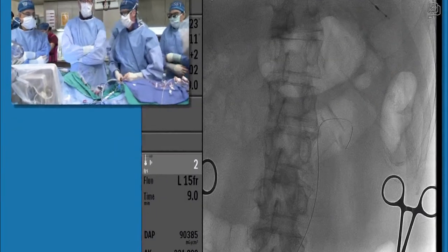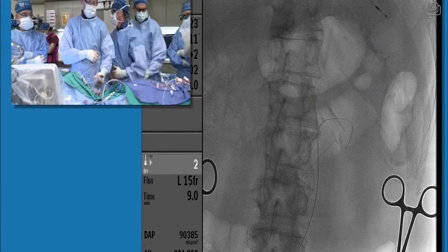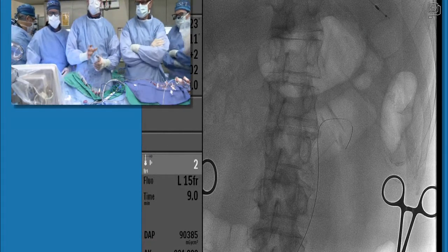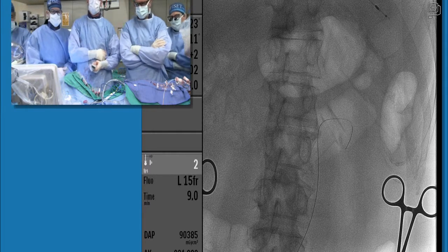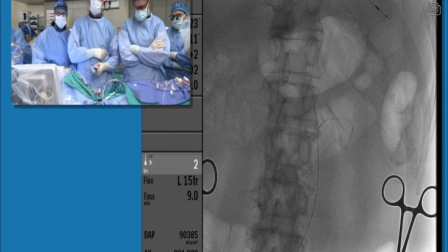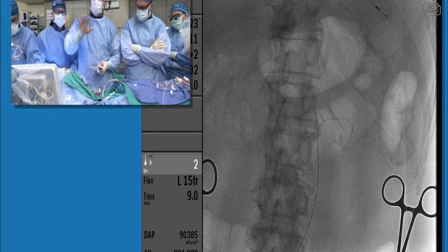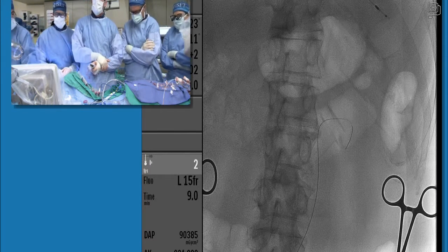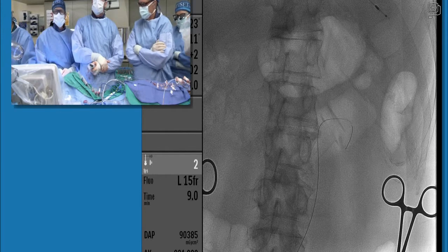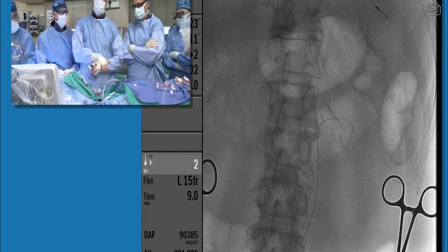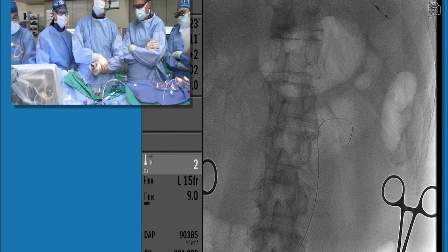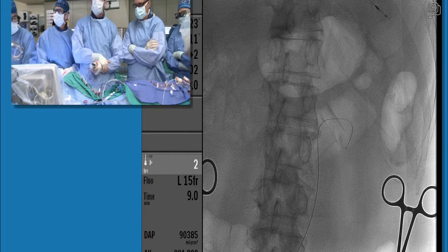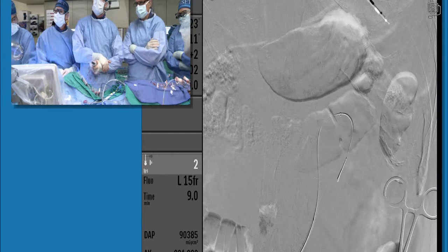Thank you, Matt. I'm going to bring you up to speed on where we are at this point. In the interest of time we didn't show a lot of axial images, but there's a fair amount of thrombus in that very short infrarenal neck, which variably can be measured at anywhere from 7 to 11 millimeters. I made the executive decision — and I've done this several times in the past — of putting a covered stent in the left renal. It helps mark exactly where the renal is. You can see the wire there.